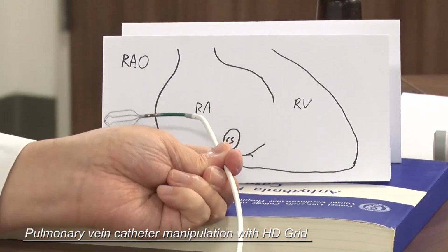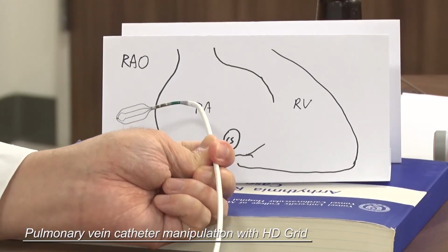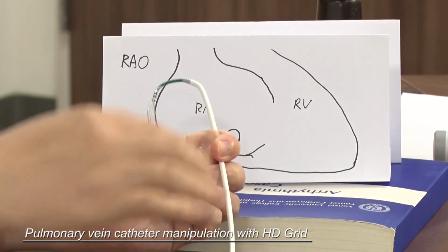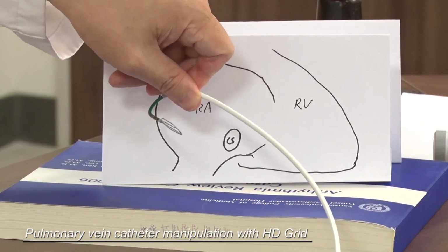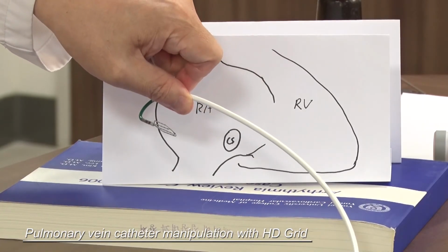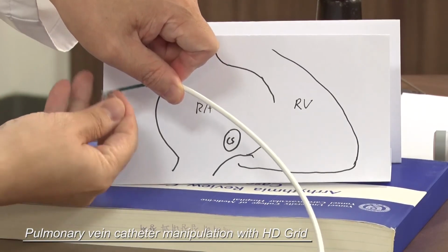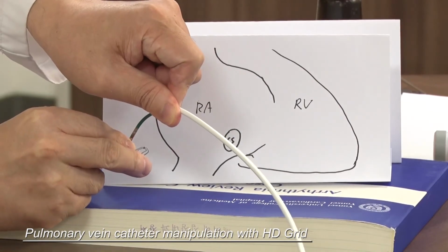Sometimes it is very difficult, especially with a small left atrial size. Then you should curve down, make a sharp curve, even this kind of sharp curve, direct it to the right inferior pulmonary vein, and open the curve. And then the catheter is moved inside the right side pulmonary vein with this position.